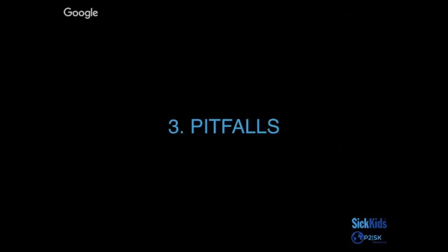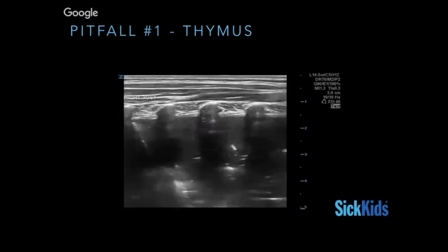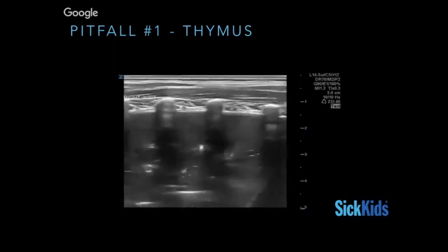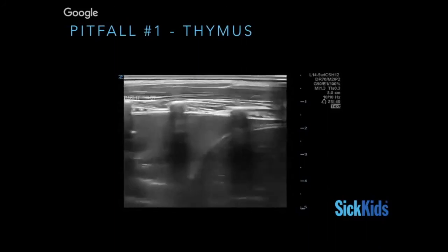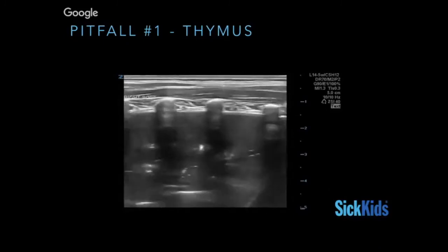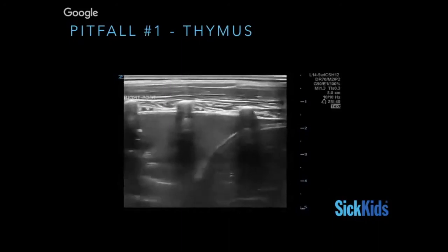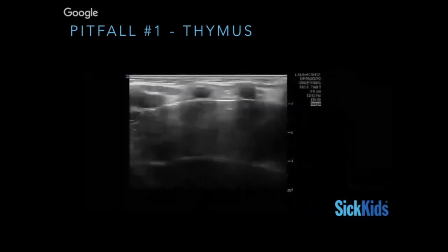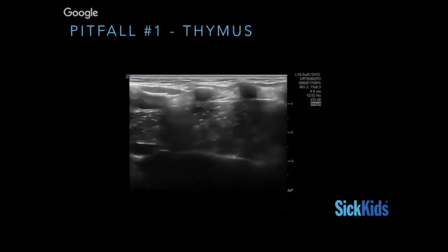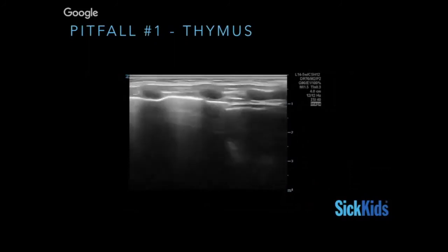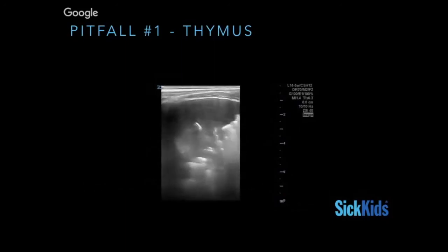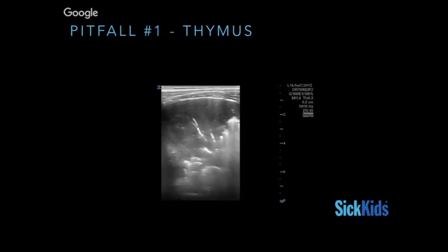To discuss some pitfalls: pitfall number one is definitely the thymus, which many adult emergency physicians may not be used to seeing and which can often be confused with pneumonia. What do you think this one looks like? This is actually a pneumonia. How do you know it's not the thymus? It's less organized and doesn't have the real starry sky appearance. As compared to the thymus, which has more defined borders and a starry sky appearance. They often describe this starry sky appearance with well-defined borders, compared to pneumonia where borders are much more irregular with focal B-lines and you often have air or fluid bronchograms within.